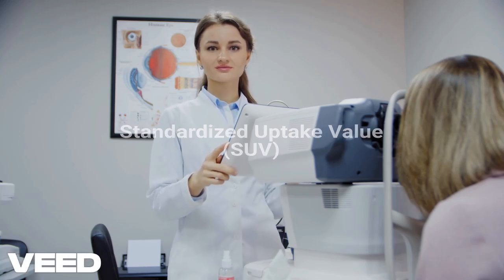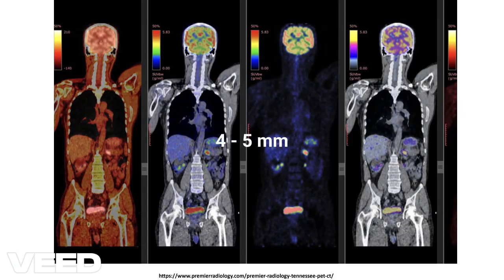However, the spatial resolution, or sharpness, of PET images is about 4 to 5 millimeters. Not bad, but still lower than CT or MRI. That's why hybrid imaging is often preferred.